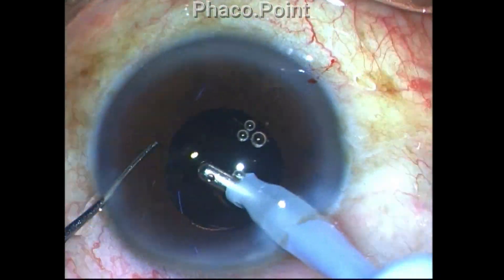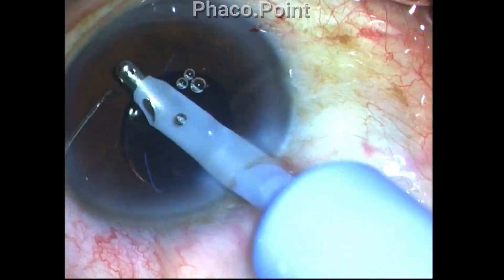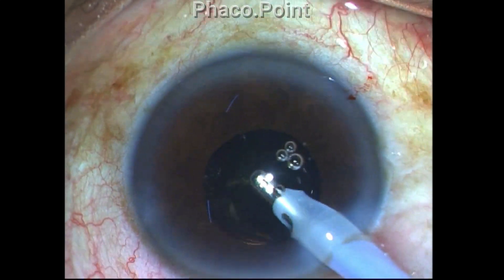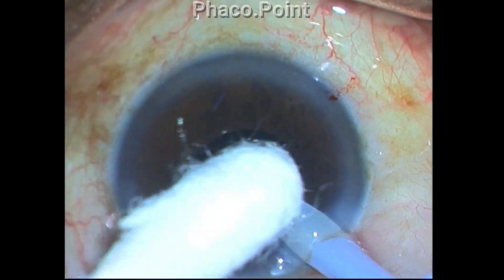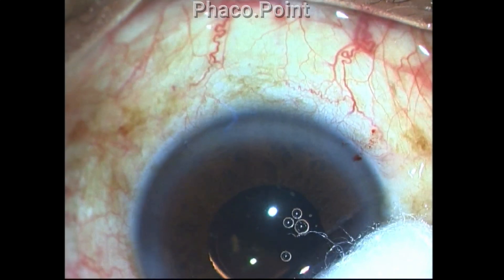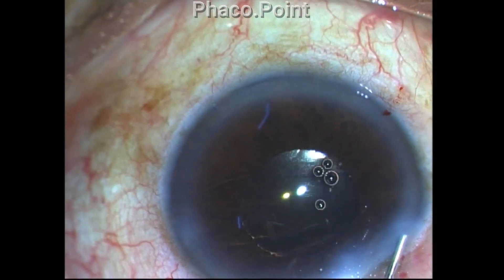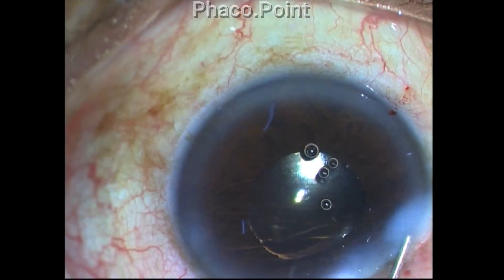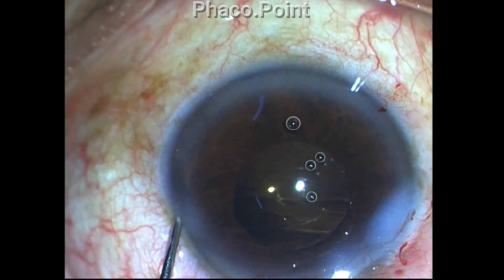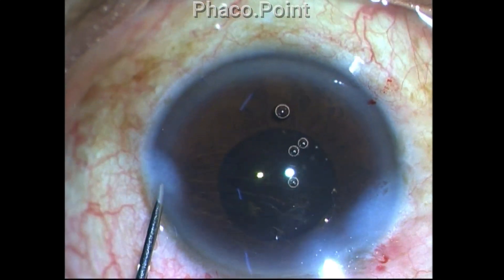At this stage I am wondering whether I should leave this little bit of lens matter behind in the Berger space, because we know that leaving behind lens matter in the eye can not only stimulate post-operative inflammation, it can cause rebound iritis and you will find it difficult to stop the patient from steroid medication. With stromal hydration, I complete the case.